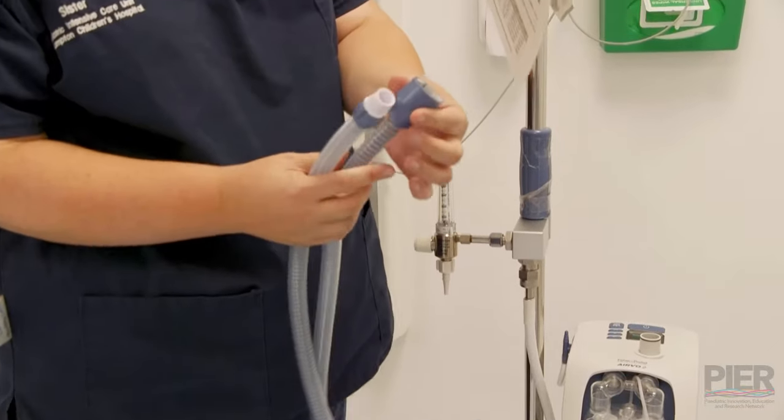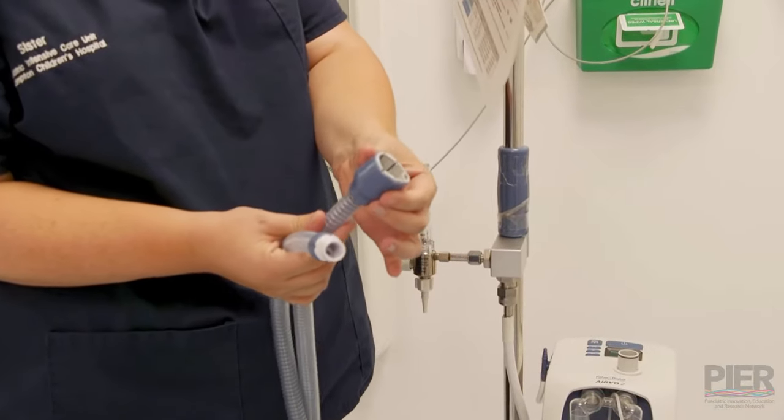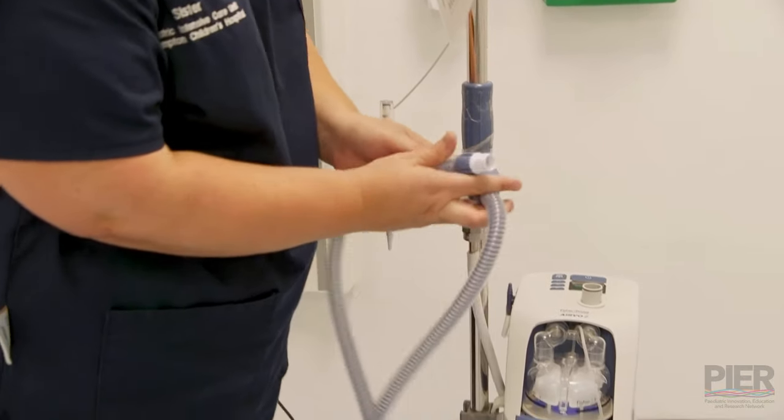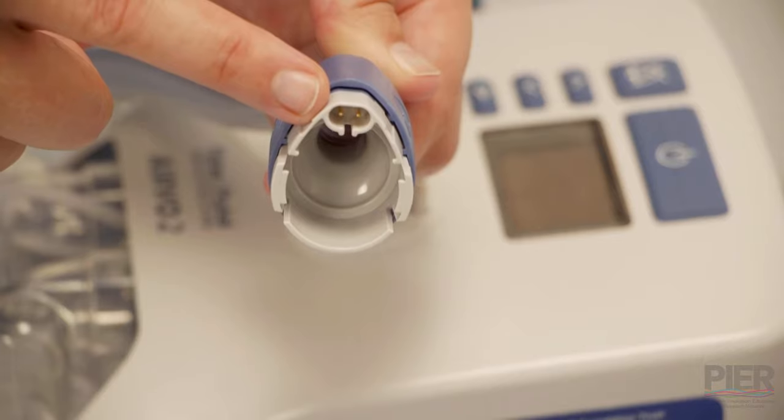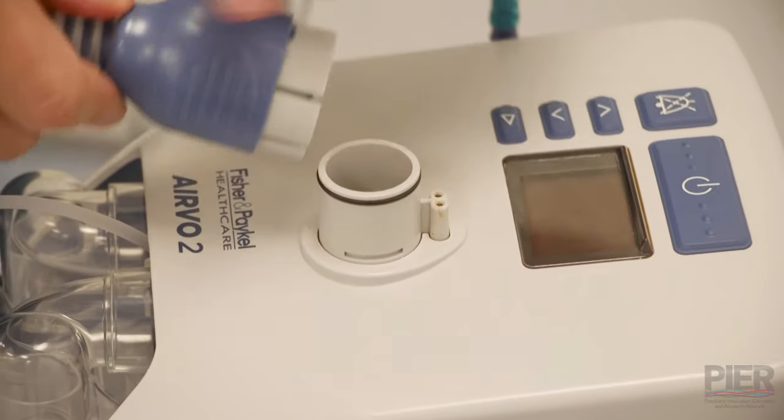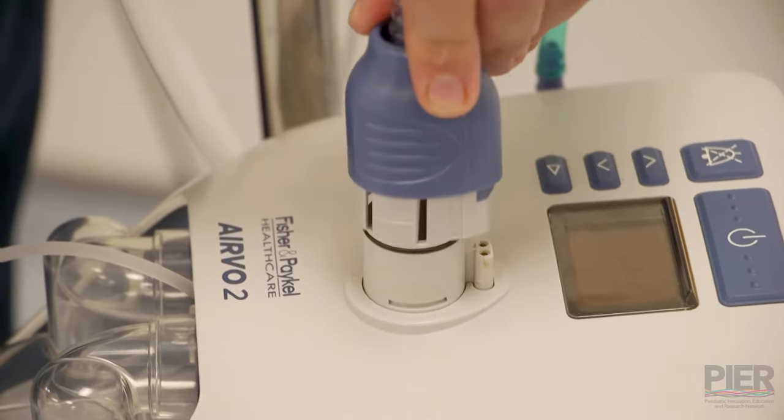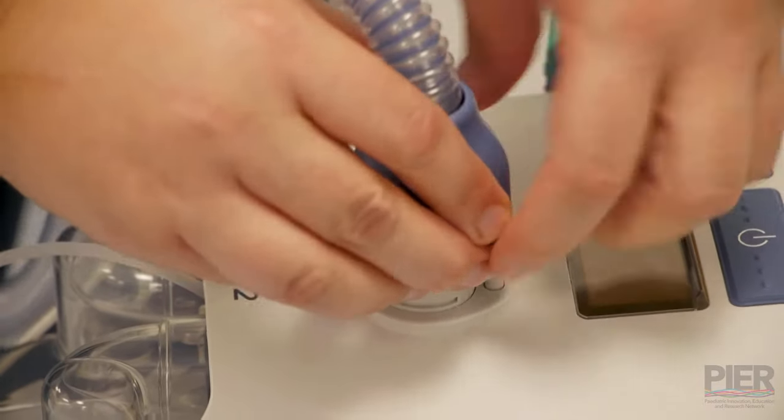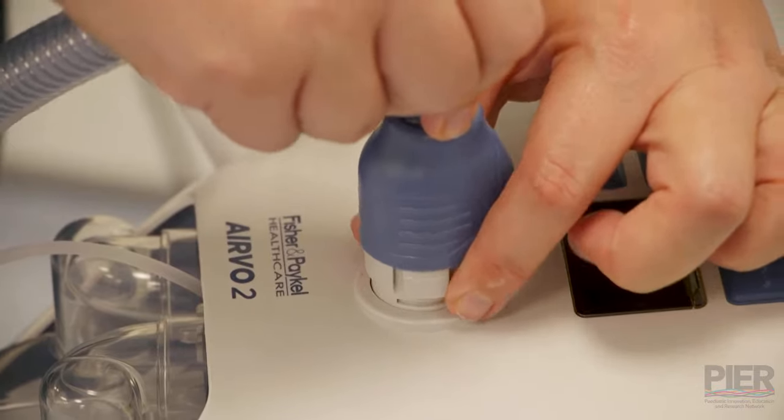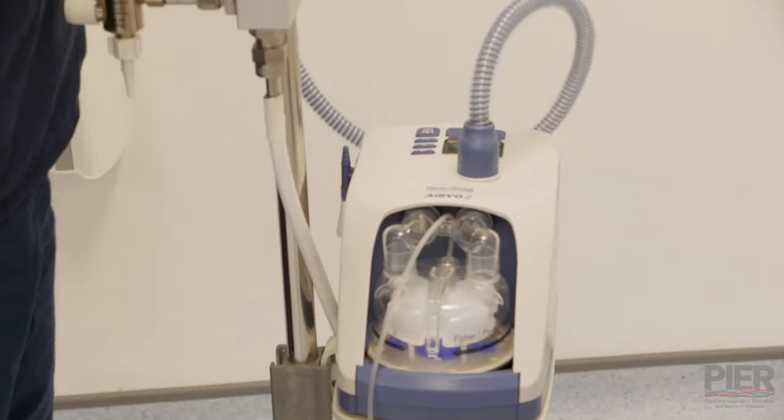This is the patient end and then this is going to go on top of the Airvo machine. When connecting the flow tubing to the Airvo, you want to make sure that you've got the top end with the two spikes going in to where the two points are there. You can lift the blue collar up, slide it down gently. Don't force it, it should just slide on easily. And then click the blue collar into place.